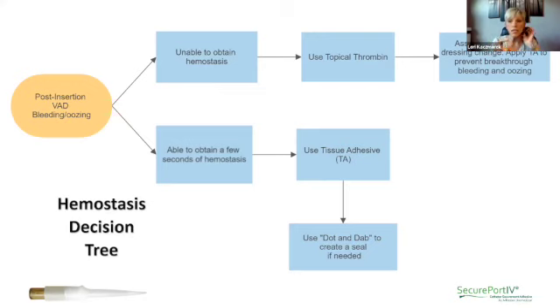My question to you though is, when you talk about waiting for it to really dry, are you putting another product on top before you put your dressing, like a disc or gel that's necessitating that, or are you just going to your dressing? As far as I know, we do one drop at the site. You wait 10 seconds for a second drop application. Generally, a drop under the hub, and then I use it around the perimeter and under the Tegaderm Advance that we use. We are using bio patches still here. We've noted that if you don't have a long enough dry time, the bio patch does adhere to the catheter. So that's why I ensure that I have a well enough dry time at the insertion site prior to laying down a layer before the Tegaderm Advance.